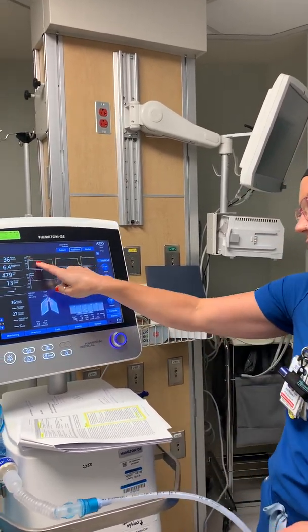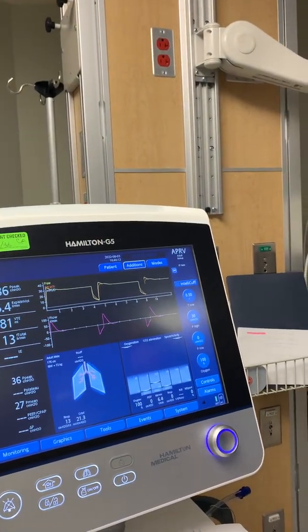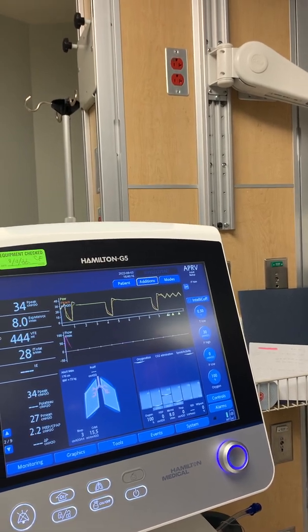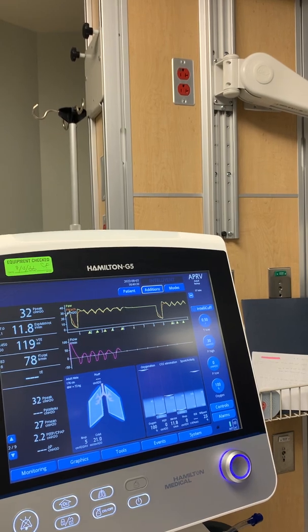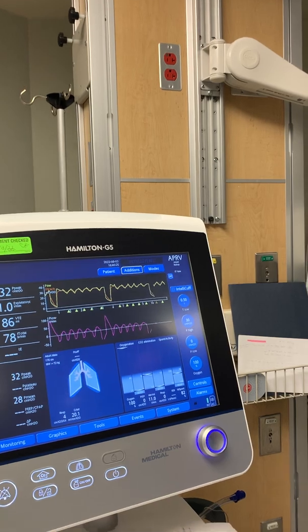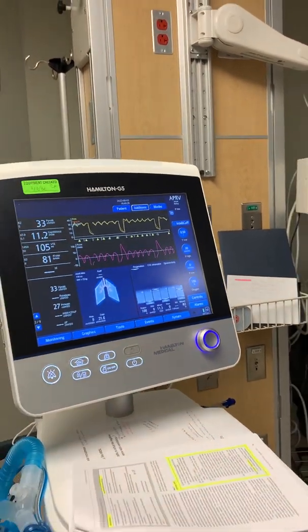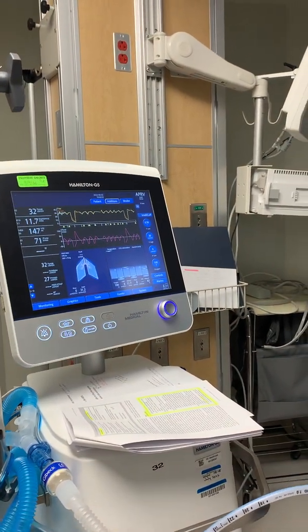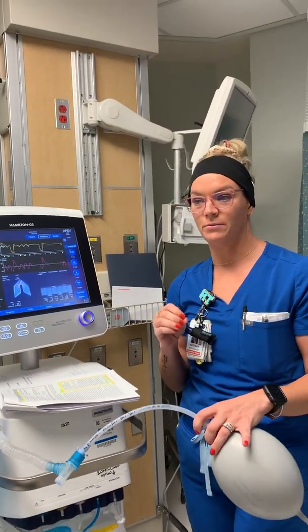On the waveform, a straight line means the patient is not taking any breaths. Those little mountains you see — that's what you want. Even 100 cc breaths or less is fine; sometimes the rate might go really high and that's okay too. You want the patient sedated enough to be comfortable, but still taking those little micro breaths.